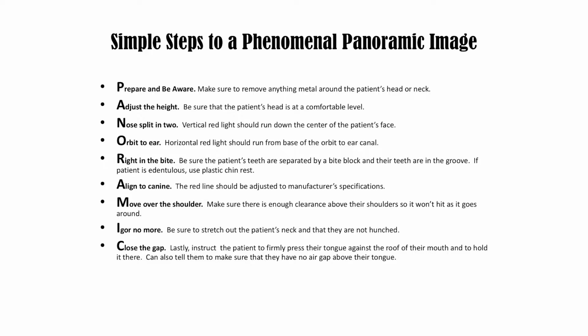And close the gap. Instruct the patient to close their lips. Keep the tongue flat against the roof of the mouth. Sometimes you'll instruct them to swallow and then keep their tongue flat against the roof of the mouth. That works, but sometimes I find patients will be trying to swallow and they don't have any spit, and then they start opening their mouth. It works sometimes, but I usually just tell them to keep their tongue flat against the roof of their mouth, kind of like a suction cup.